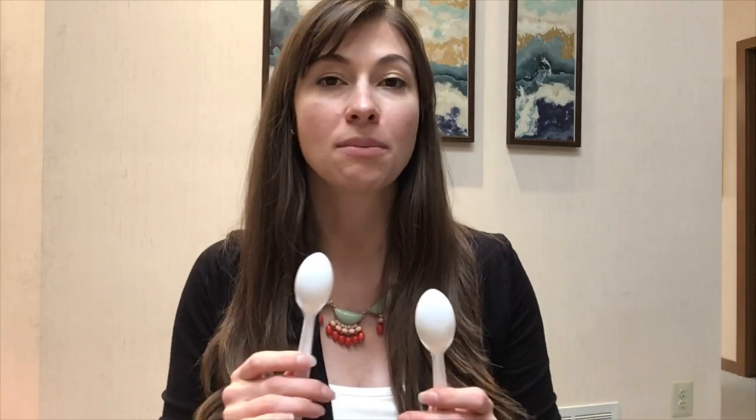These next two pictures are really important for me to see how your bite is in the back, so you're going to do the same thing but one for each side. Take your spoons, put them in your cheeks, and bite again on your back teeth.